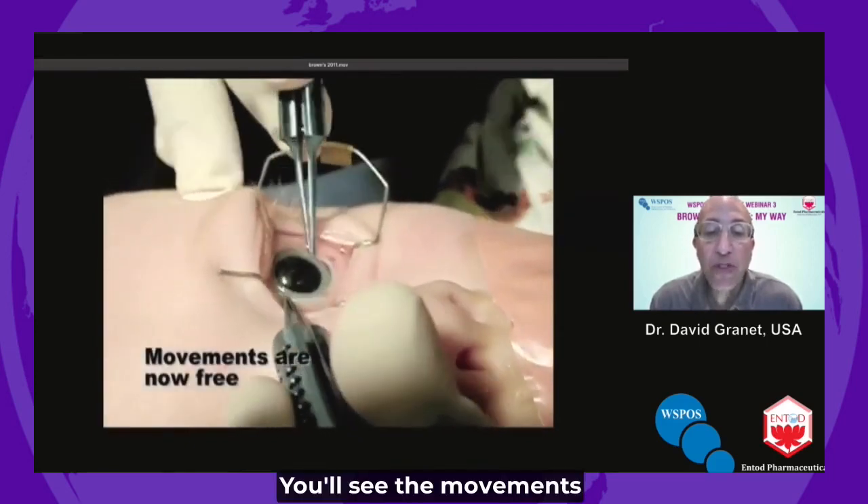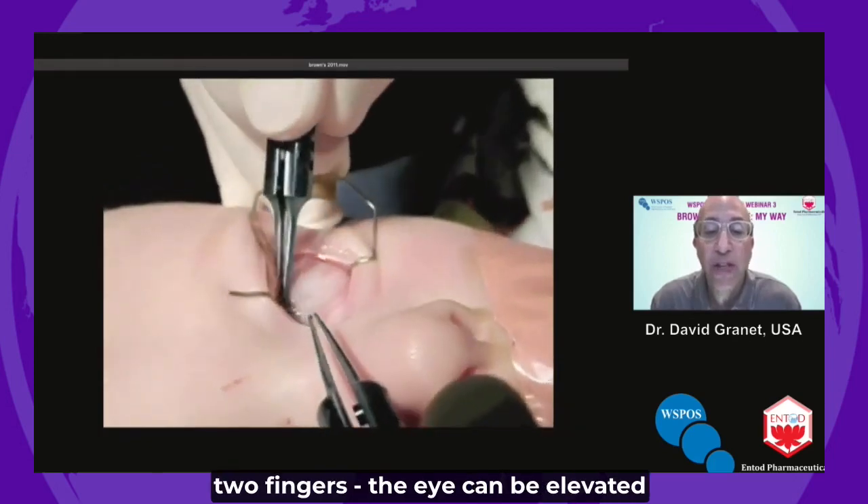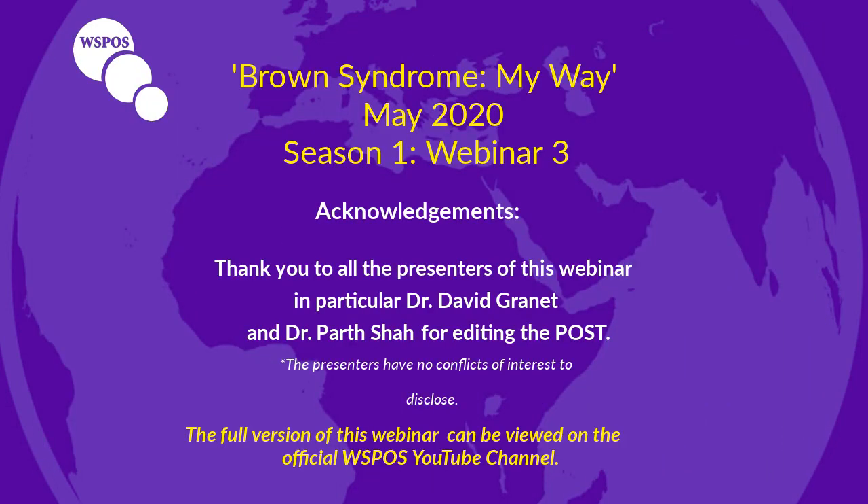You'll see the movements are now completely free — full cyclorotation, and with one hand and two fingers the eye can be elevated into adduction.